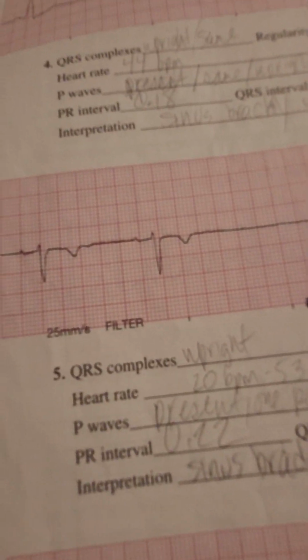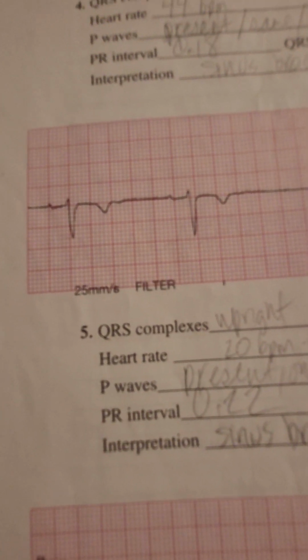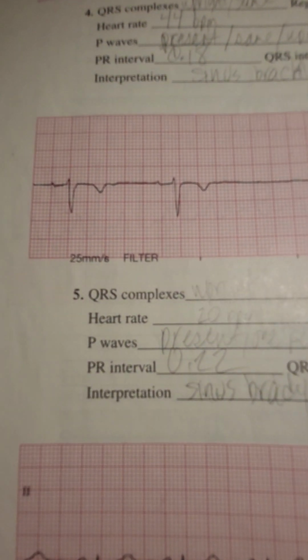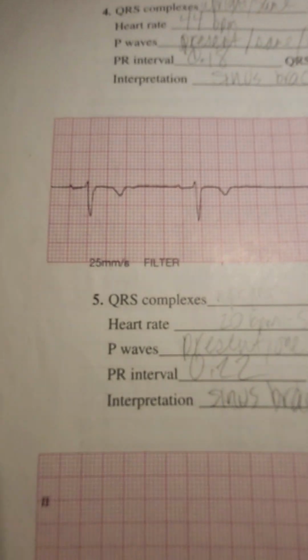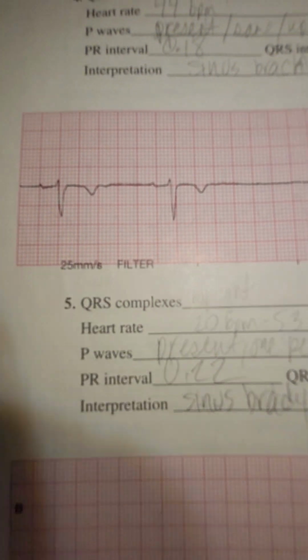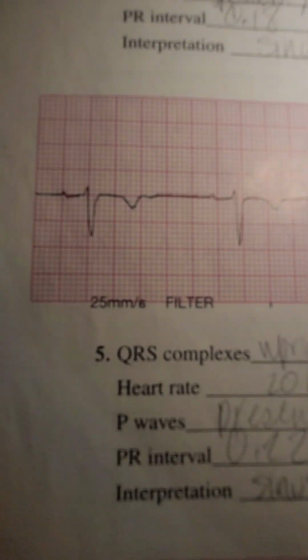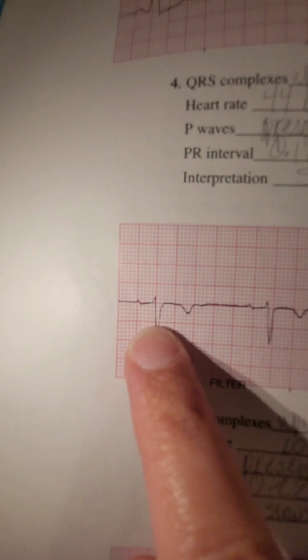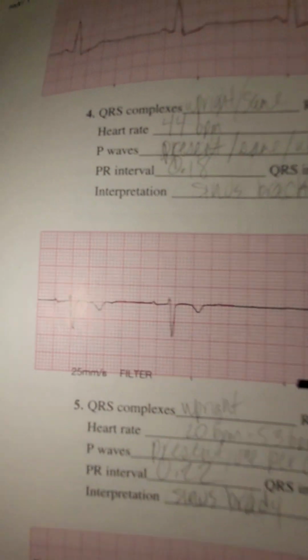It might be an AV junction rhythm, but I think for the most part, the first thing you should do is ask the nurses or the PCAs about the leads. If the P waves were inverted, like down, down, down, down, and the QRS is still okay like this, just make sure the P waves are up.